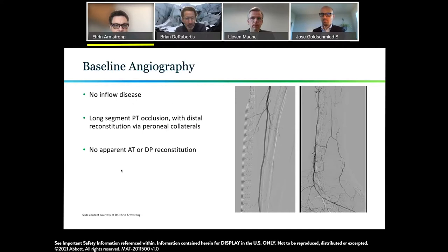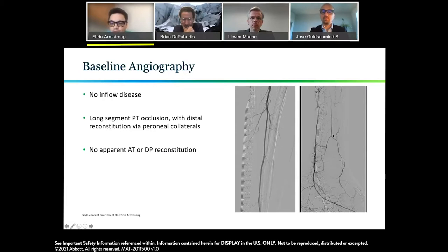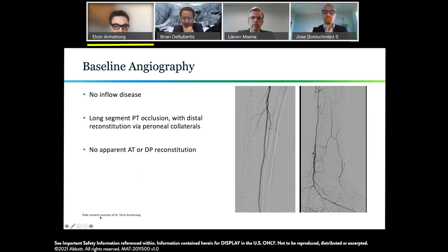Consistent with that, baseline angiography showed no inflow disease. The patient did, however, have a long-segment posterior tibial occlusion with distal reconstitution via peroneal collaterals. On the still frames, there's a distal popliteal and a peroneal artery that appears to be the main runoff to the foot. There's an occlusion of the posterior tibial near its origin, and posterior communicating branches of the peroneal artery reconstitute the posterior tibial just above the level of the malleolus. There was no apparent reconstitution of the dorsalis pedis or the anterior tibial, making this essentially a one-vessel runoff through the peroneal artery.